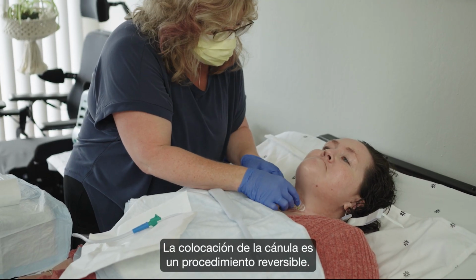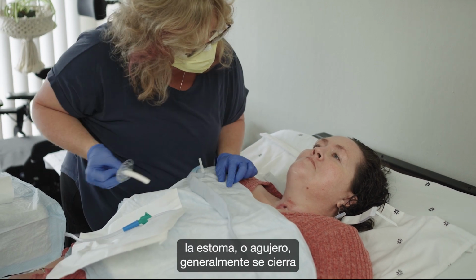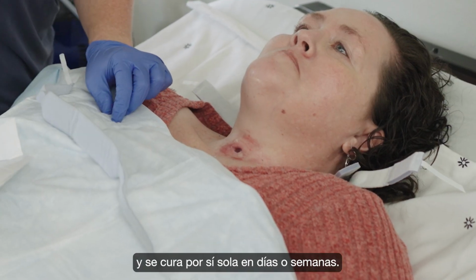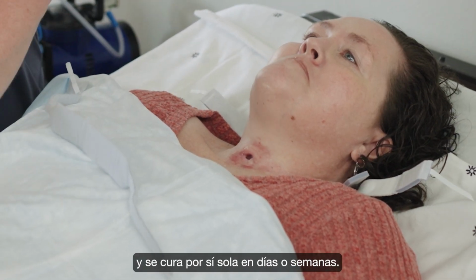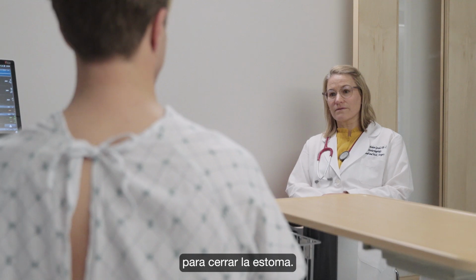Trach tube placement is a reversible procedure. When the tube is removed, the stoma, or hole, most commonly closes and heals in days to weeks on its own. Rarely, a secondary procedure is needed to close the stoma.